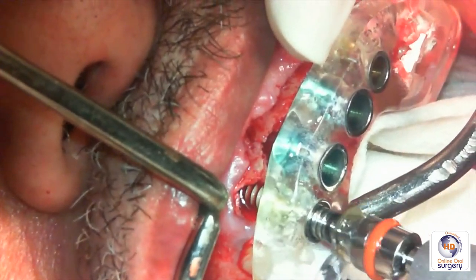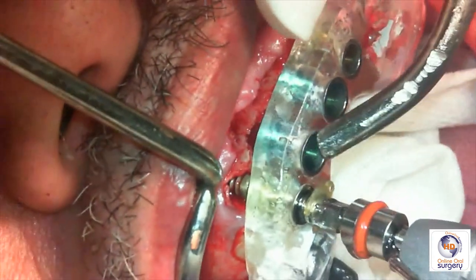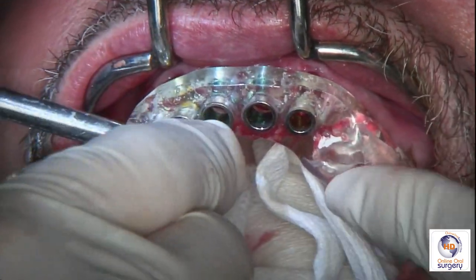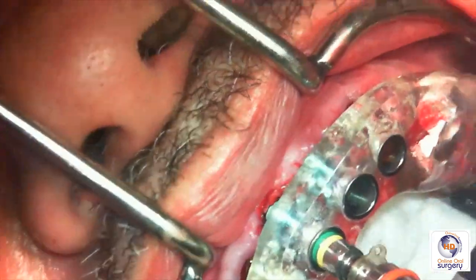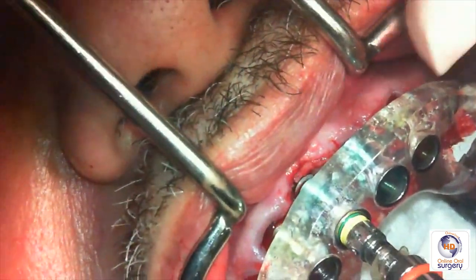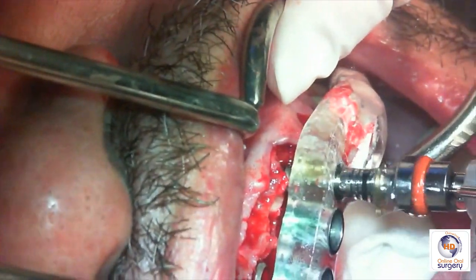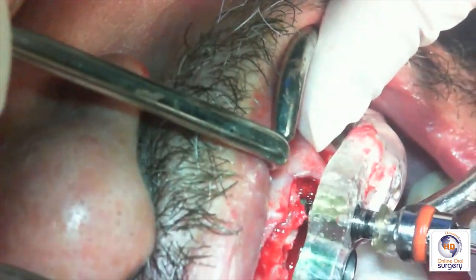We're going to do this with the irrigation turned on, and you'll notice the disposable depth stop ring that we have in place, and that's to help free up either my or my assistant's hand. So that's going to go all the way to depth. We're going to use the same process to place the fixtures at sites number 8, 9, and 10. And again, we have the disposable stop ring that is used to control the depth of implant placement.